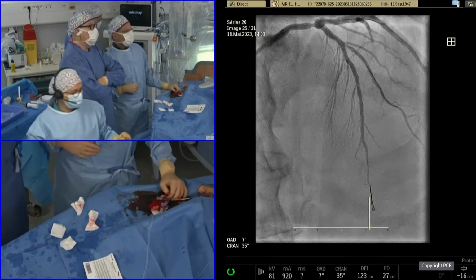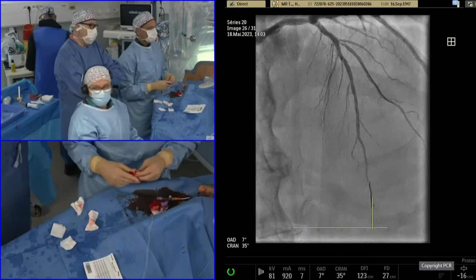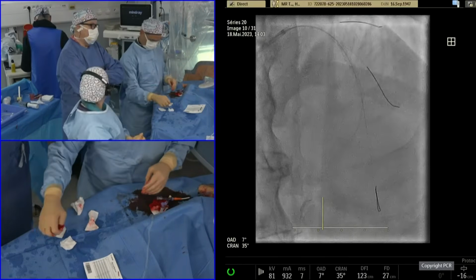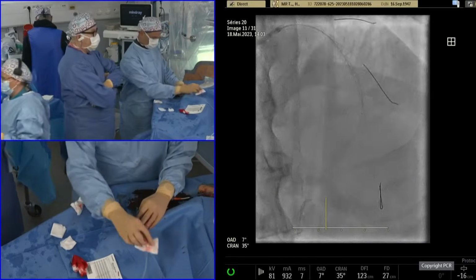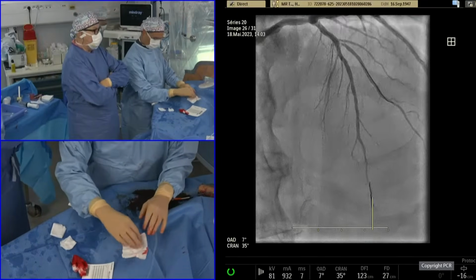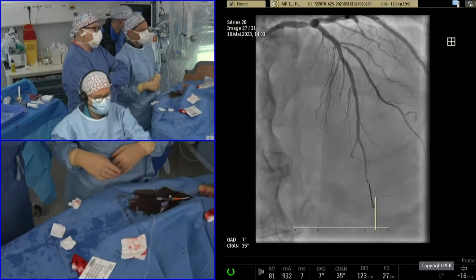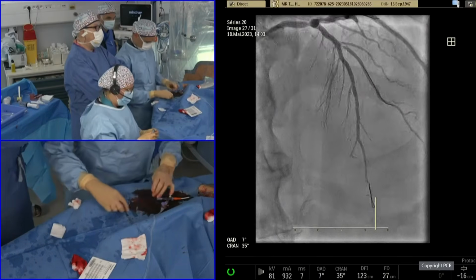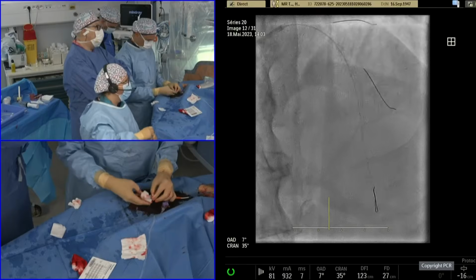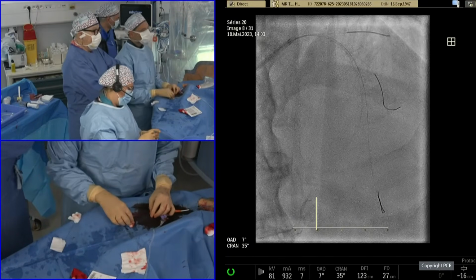Okay, Bernard, your KISS trial really helped us understand that outside of the left main, no need for routine kissing balloon inflation is required. But can you comment on this result now? It's a typical example of patients from the KISS trial. So the side branch is patent after doing the POT. And this is the type of patient we randomized between side branch and no side branch interventions.